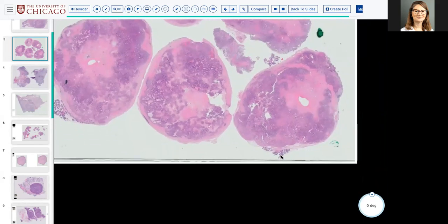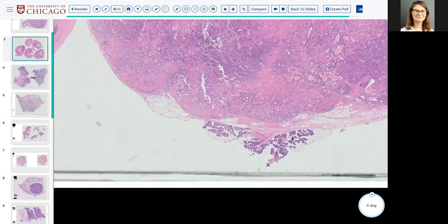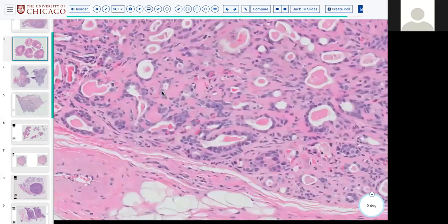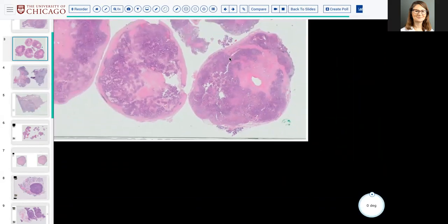Thank you. Those are some good observations regarding the cytomorphology of those cells. Does anybody agree or disagree with the final conclusion here? Yeah, even I thought it's carcinoma ex pleomorphic adenoma, maybe salivary duct carcinoma. Yeah. And my question for you both is, what component do you think is invasive?